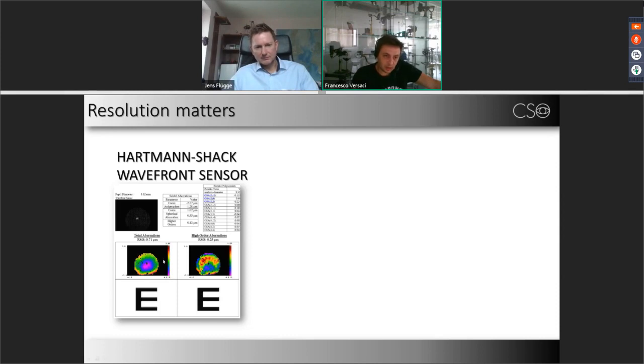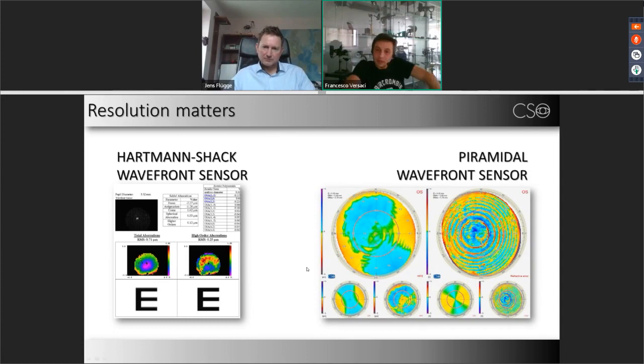So you can see that we have rough squares on the color image in the middle of the printout. And this one is the same case with our wavefront sensor. So you can easily see, both in the wavefront error and refractive error maps, the rings of the diffractive lens that this patient has in place, and you can see every small deformation of the wavefront.